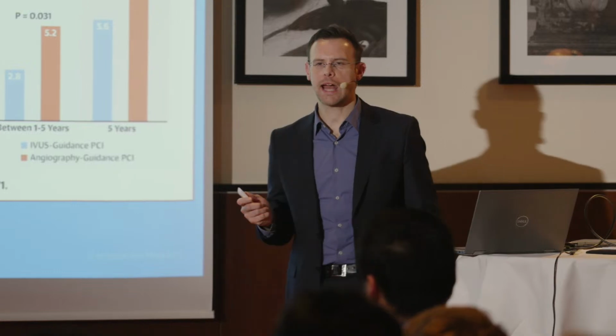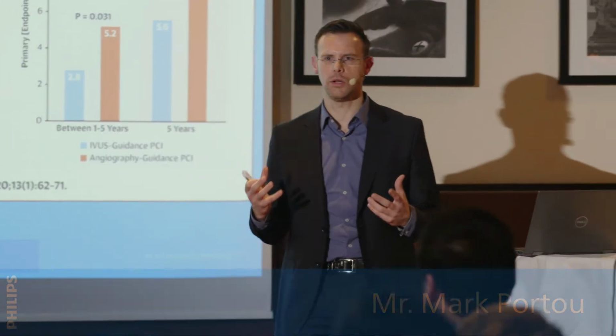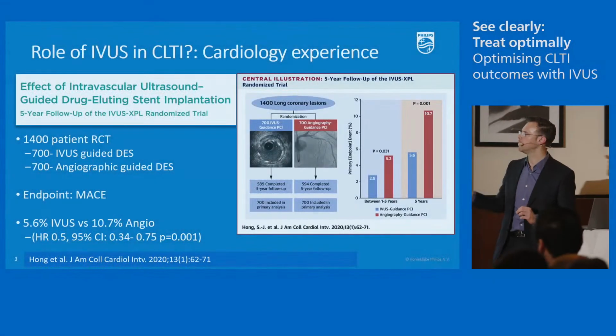Well, it turns out that actually cardiology have been using endoluminal imaging, I think, far more widespread than we have in the peripheries. Whether you're talking about IVUS, OCT, or otherwise, they do tend to use this a lot more than us. Are they better funded? Are they more interested? Well, the answer is probably. But what can we learn from them?